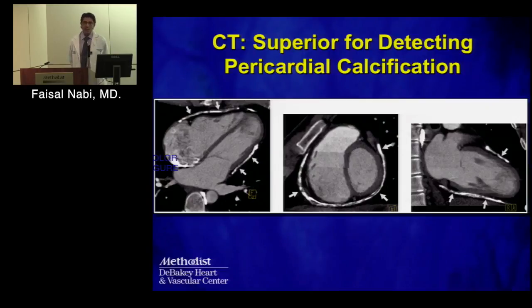Yes, it's faster. Where it would suffer is, yes, tissue characterization maybe a little bit. But at that point in time, you don't care. Because if you have a big hematoma compressing the heart, you're going to see it, in conjunction with echo. I'm sort of leaning to you because we always use TEE, but even with TEE, sometimes we struggle to really see the whole spatial orientation of a hematoma compressing the heart.